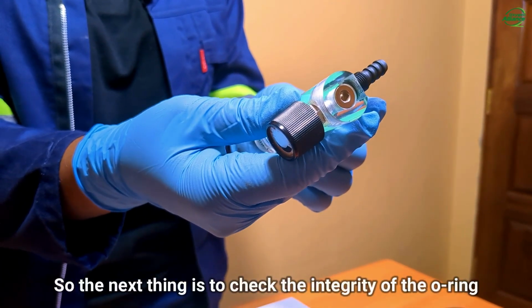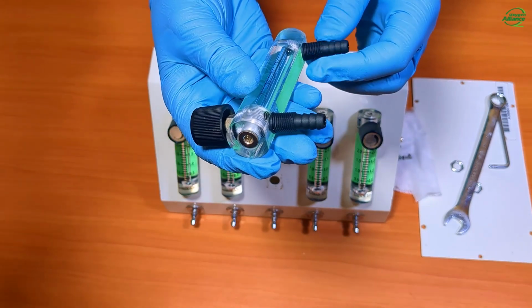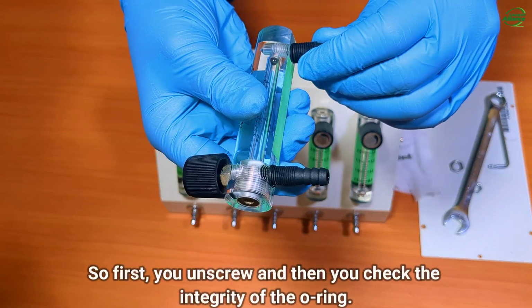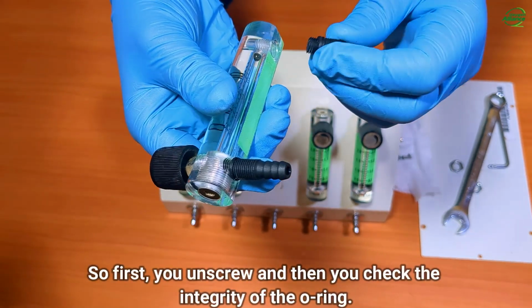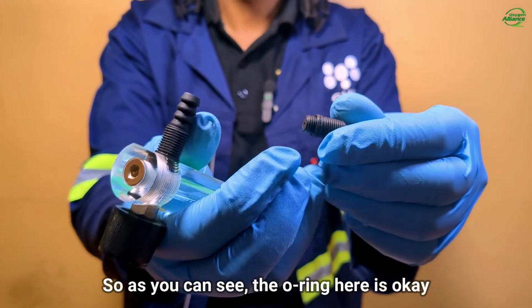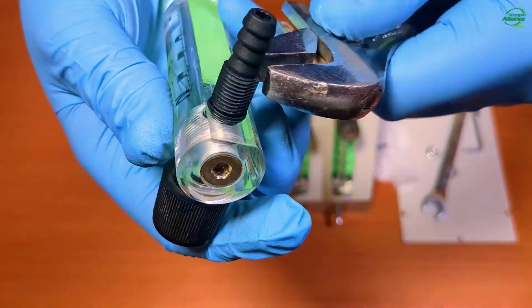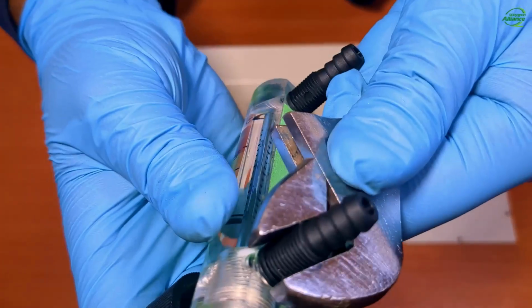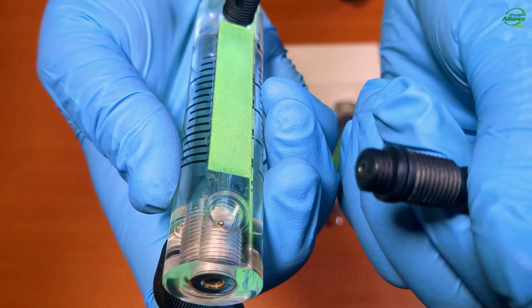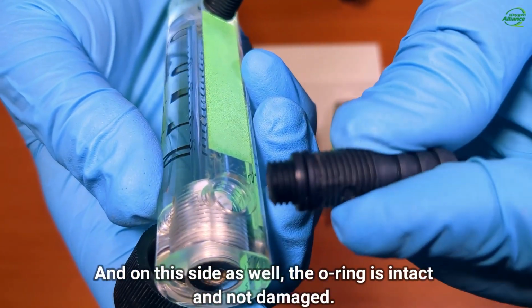So the next thing is to check the integrity of the O-ring. So you have 3 O-rings on each flow meter. There's one here, here, and here. So first you unscrew and then you check the integrity of the O-ring. So as you can see, the O-ring here is okay. So I'm going to put it back. And on this side as well, the O-ring is intact and is not damaged.